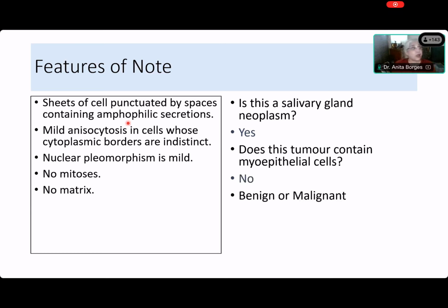Now tell me, who was answering, Madhu or Akshara? Madhu, I think. Is it benign or malignant? Malignant. All right. Why? Because it behaves like malignant. What's the diagnosis? You're saying behaves like malignant. I think it is a secretory carcinoma. You think it's a secretory carcinoma, but why?